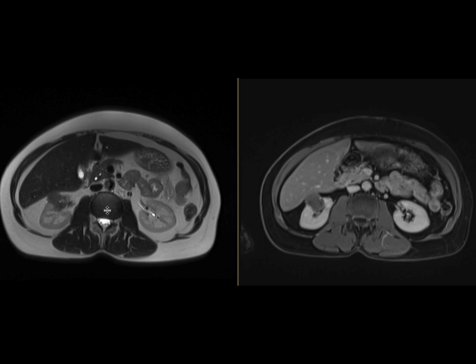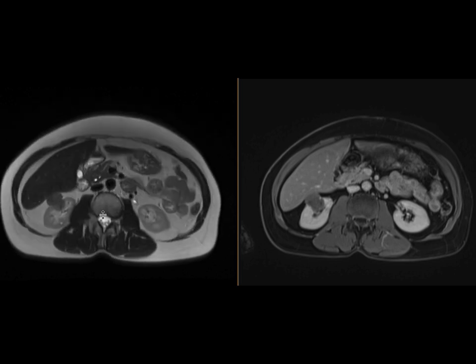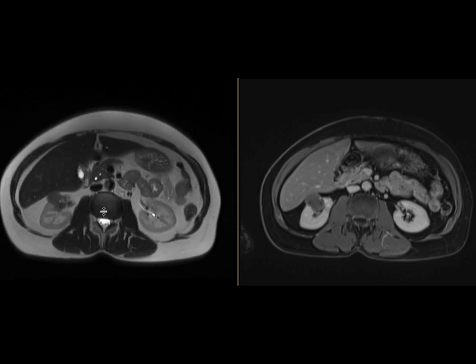The only other differential to consider would be a lipid-poor angiomyolipoma. Those tend to have more brisk enhancement, and the T2 signal is more similar to muscle — you can see it here resembling the paraspinal muscle. So T2 signal similar to paraspinal muscle with brisk enhancement would suggest a lipid-poor angiomyolipoma.